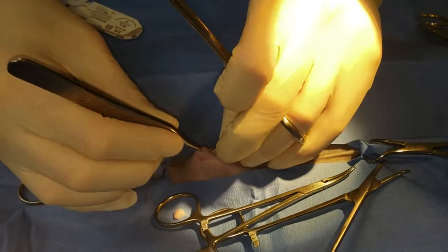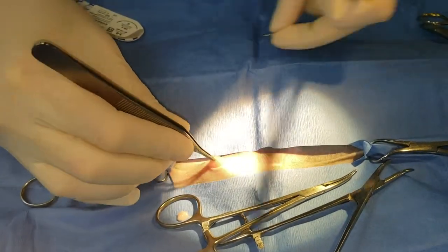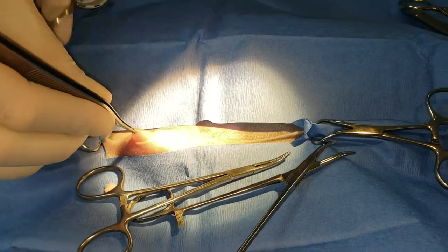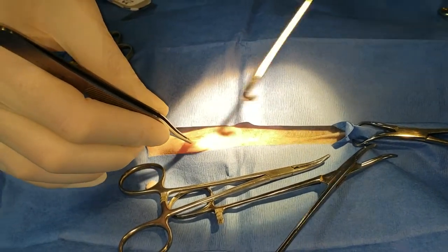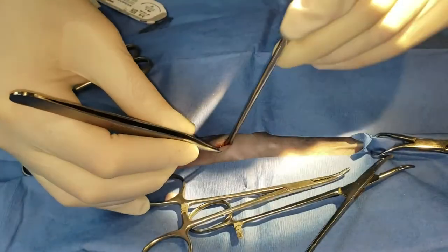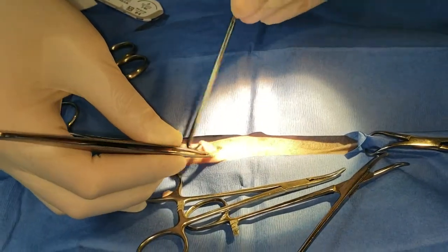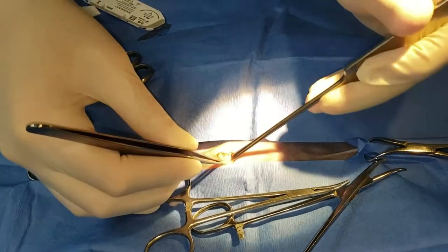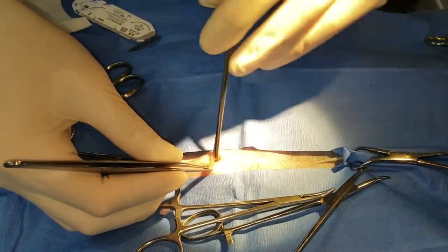Tent the tissue or tent the body wall, make a stab incision, use my Metzenbaums to open that incision and pierce through the peritoneum if I hadn't gone through that already, and then just mess around with the spay hook. I'm sure you guys are pretty good at doing that. It takes me a couple of tries on this one — there's always those magic ones where I get it right away, which is not here.